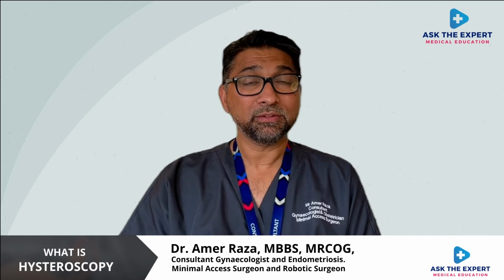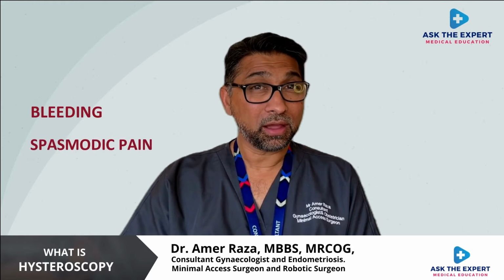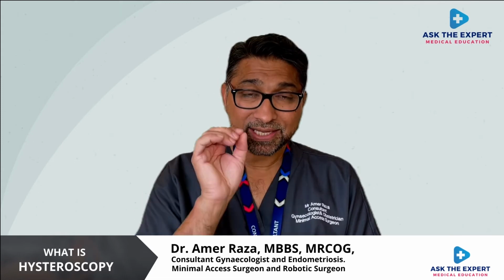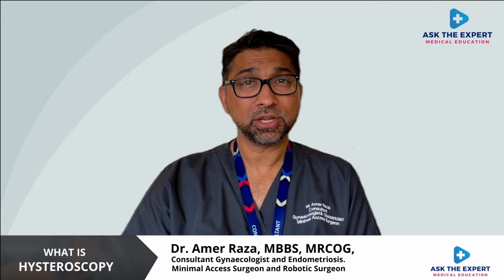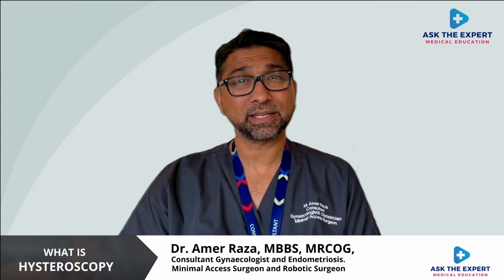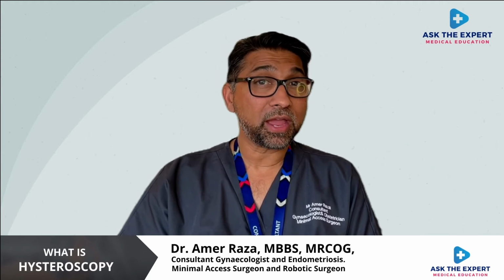The second common thing will be slight bleeding after the procedure. And third, some spasmodic pain after the procedure. There is also a risk of false passage as the camera is inserted. If the birth canal is tightly closed, then at times the camera can make a false passage. The risk of perforation is very small in an outpatient setting.